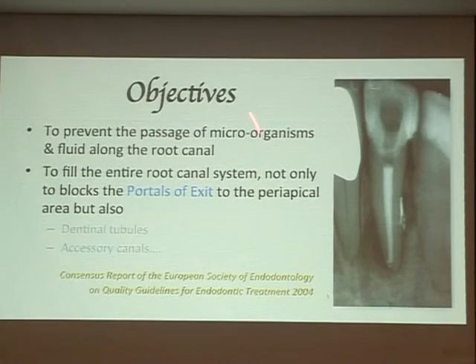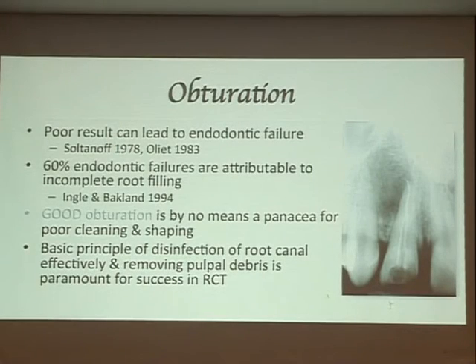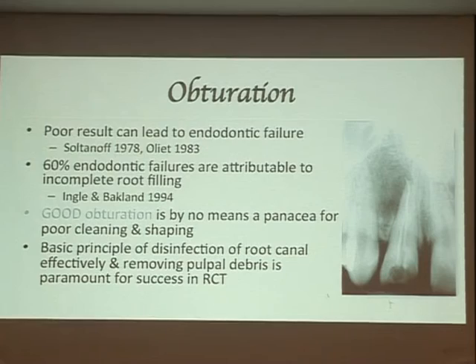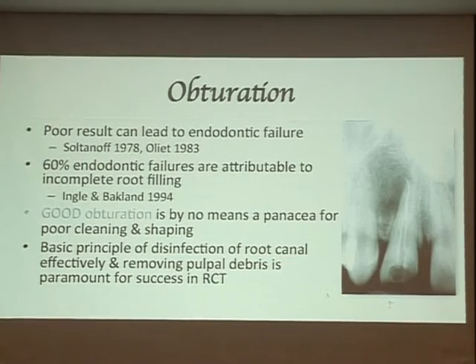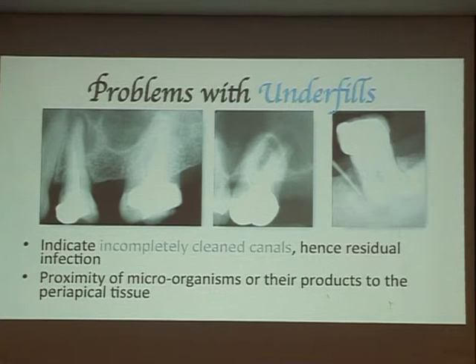Filling the root canals. Everyone knows that we have to fill up the canals. Many techniques. Should we use one technique? I would say the ideal technique is warm and bonded. The most important thing is that underfilling will cause a problem. People say overfill, but I don't think so. I think underfilled canals will cause more problems because they contain necrotic tissue. So you can see in underfilled cases, a lot of the canal was not clean.